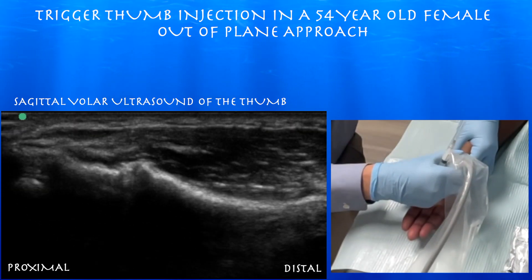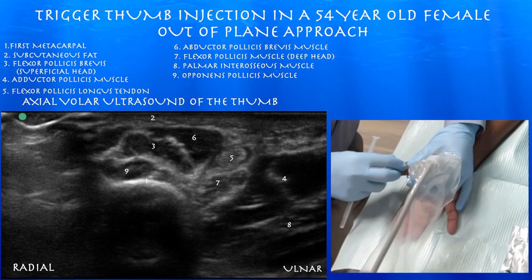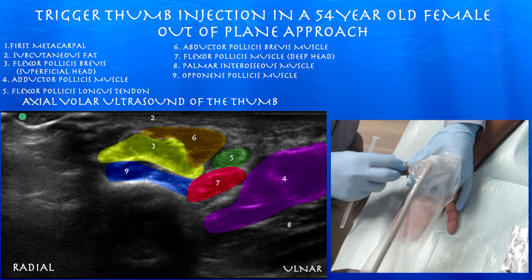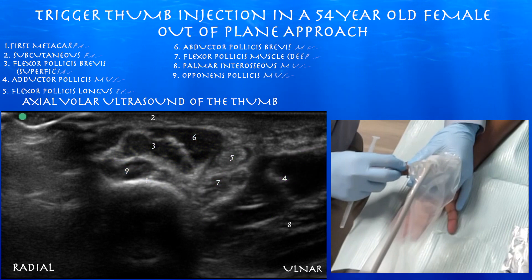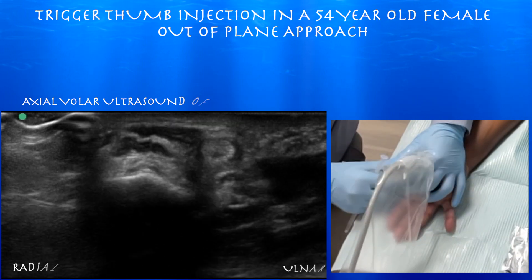Here you can appreciate the bony contours a little bit more clearly. Now we're looking at the flexor pollicis longus tendon in short axis. You can appreciate the layering of the thenar musculature, and also the two heads of the flexor pollicis brevis muscle — the superficial and deep heads.